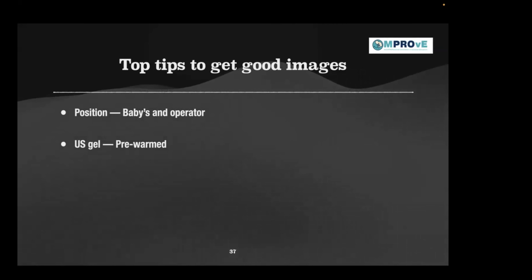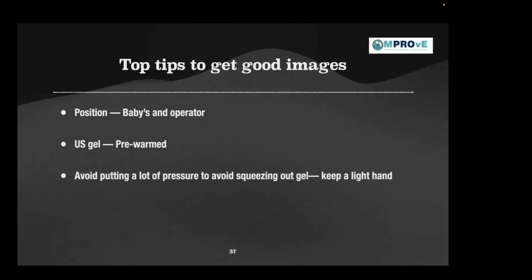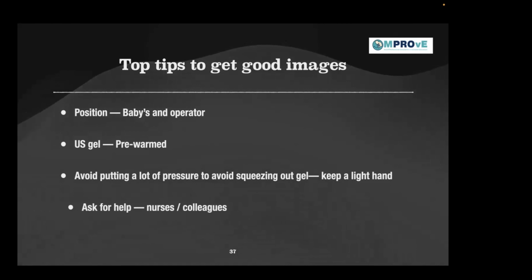The second most important thing with gel application is that you don't put a lot of pressure on your probe, because if you do, it's going to squeeze out your gel. If you're squeezing out your gel, it's no good. You're going to have pockets of air again. So keep a very light hand while doing a lung scan, and believe me, it will give you brilliant images.